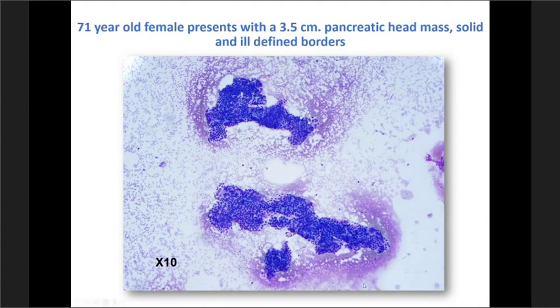This is low power view. Background is relatively clean, only blood, but I do have quite a few sheets over here, and you'll have to take my word on this slide. There were many, many sheets similar to this. So quantitation was not an issue.